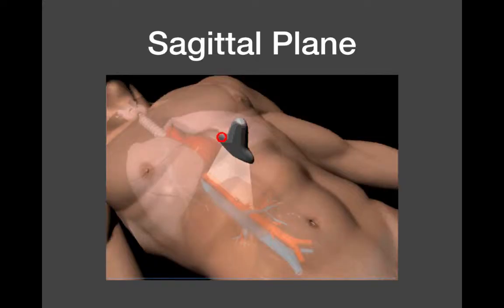In my opinion, once you've swept that abdominal aorta in the transverse plane and you don't see a AAA, you're done, right? If you're doing a RUSH exam or whatever mnemonic you want to use for the ultrasound survey of the critically ill patient, you can march on to your next modality. If you find a AAA, you need to be able to turn sagittally on it, okay?